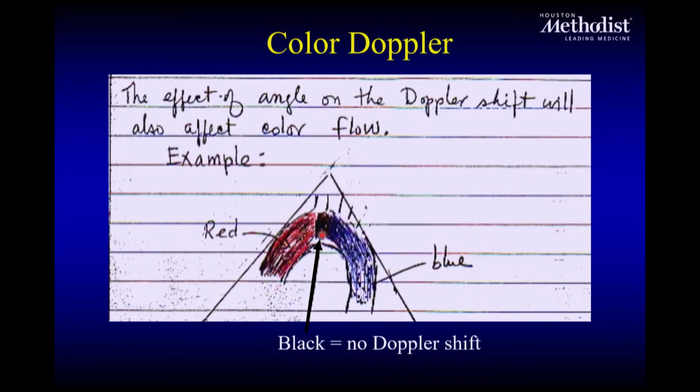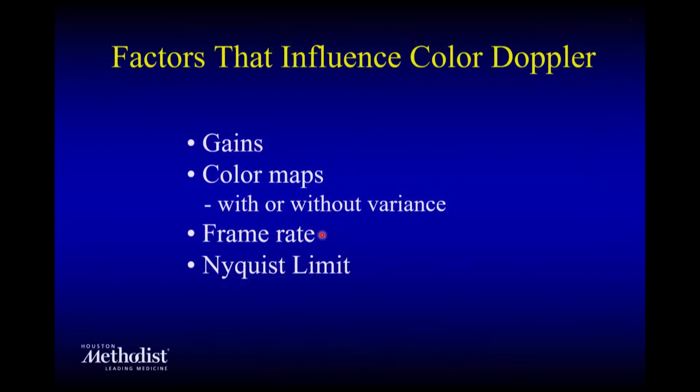As opposed to mitral regurgitation and the PISA: the velocity in PISA starts slow, then accelerates and aliases, so there won't be any black in between. It goes from low velocity to high velocity.